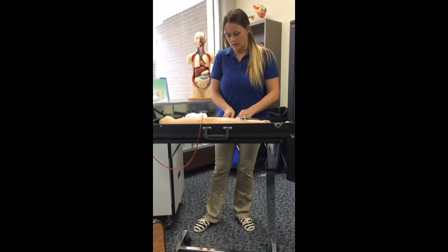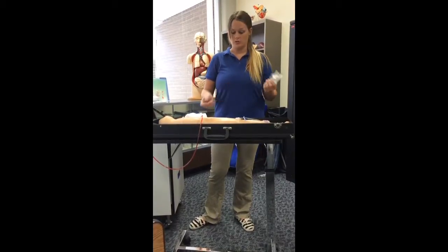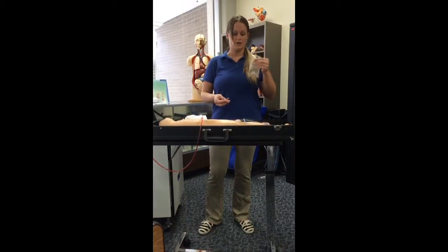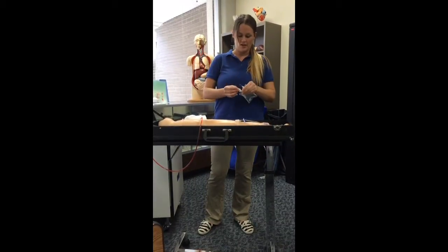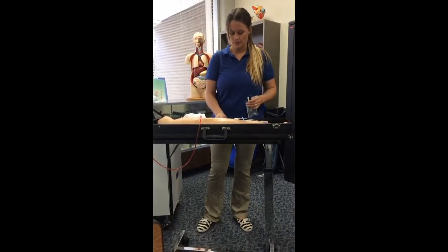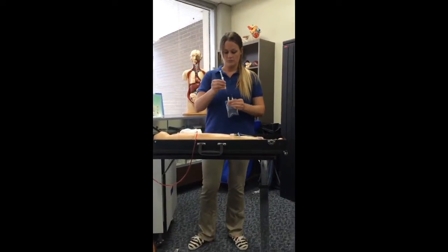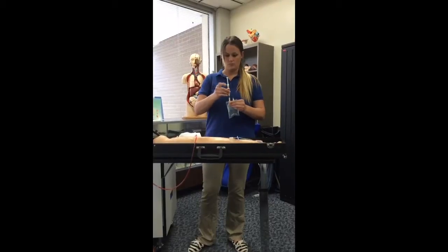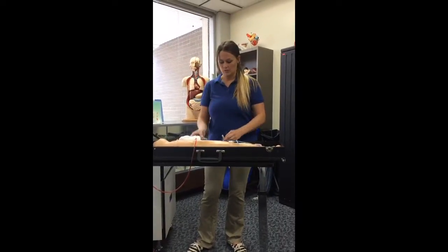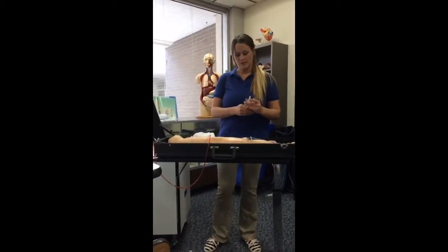Then I'm going to take my bag of 100 ml of saline solution. I know that this is really a 50, but we're going to pretend that it's 100. And I'm going to wipe my port. Insert the medication. Then I'm going to toss this into the sharps container. I'm going to mix my medication up.